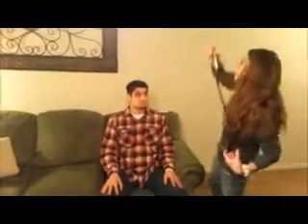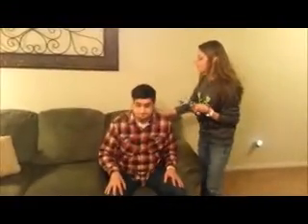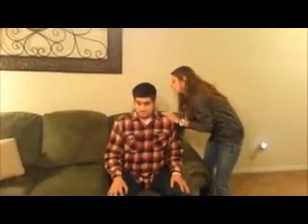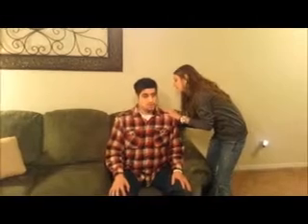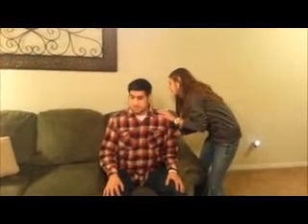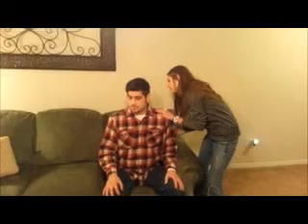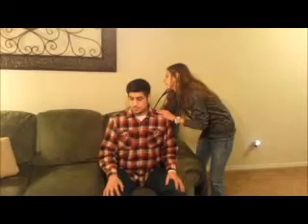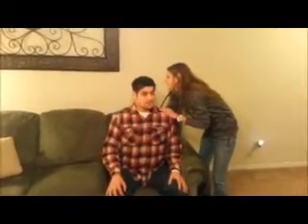I am next going to auscultate. I am going to use the diaphragm on my stethoscope to listen to normal heart, lung, and bowel sounds. I can also use the bell of my stethoscope to listen to any abnormal sounds such as heart murmurs. I have you lean forward. Couple of deep breaths. Good. You can breathe normal.